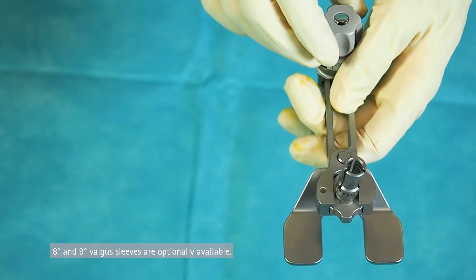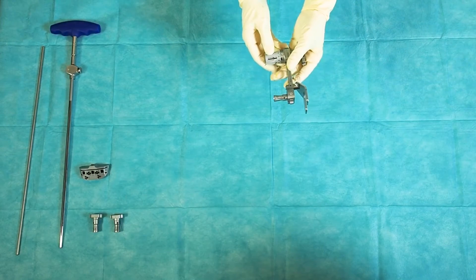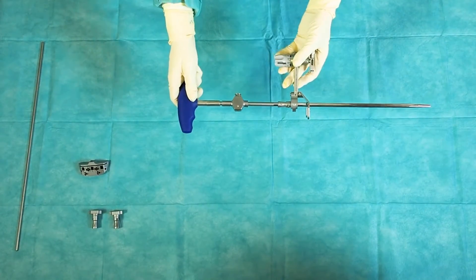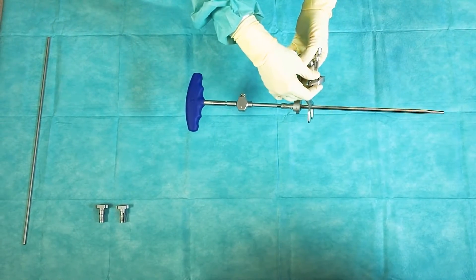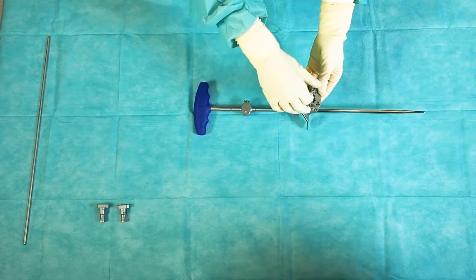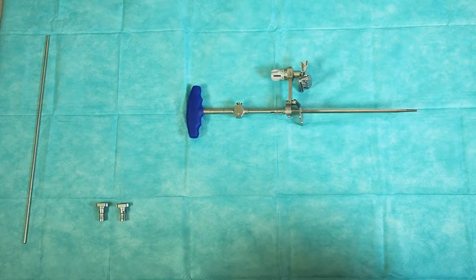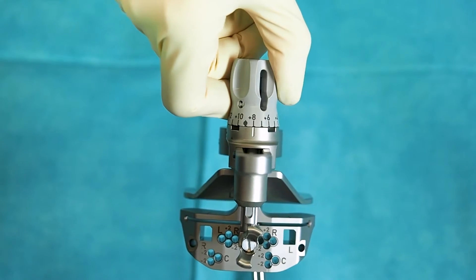8 and 9 degrees are optionally available. The assembly is slided over the intramedullary rod. Engage the assembly in the central connection square of the distal femur cutting guide. The standard resection level is 9 mm according to the distal femur implant thickness.